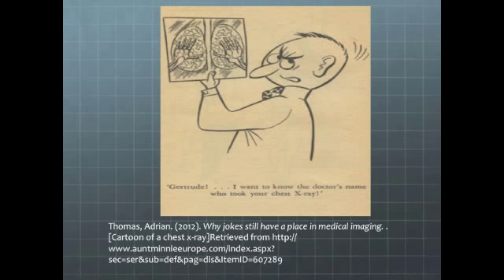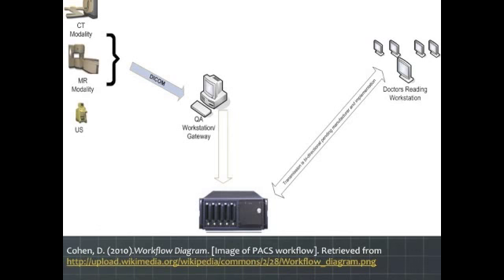You had to go in a dark room, develop the film, right? You had some daylight processors where you could send your images from CT and MRI, which are hundreds and hundreds of images. They would print out, say, 20 on what's called daylight film, which you could expose, or didn't expose when you brought it to light. Regular X-ray, we had cassettes that we actually put film in, similar to film in your cameras. Kind of like an old school Polaroid. A Polaroid would be like a daylight processor kind. It was like film. If you opened the little carriage, you would expose it, and you can't see your images. Wow. Expose it to light.